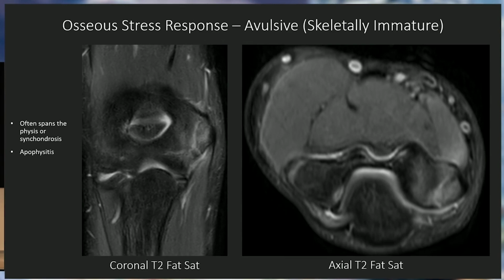Inferior pubic ramus fracture in a kid is a pretty significant injury, usually with a straddle injury, and you get potential genitourinary injuries. But that's a great example of something that just looks very irregular and very abnormal, but it's just a variant of normal developmental variation.